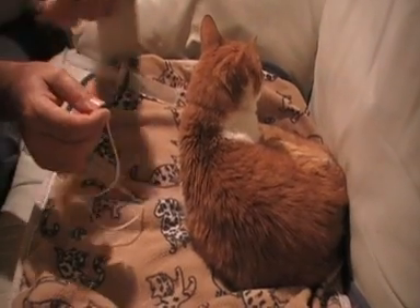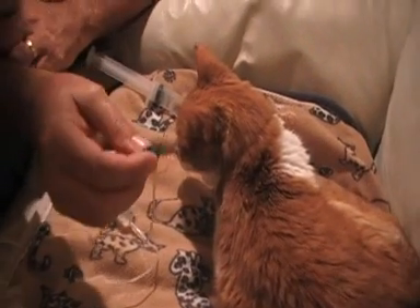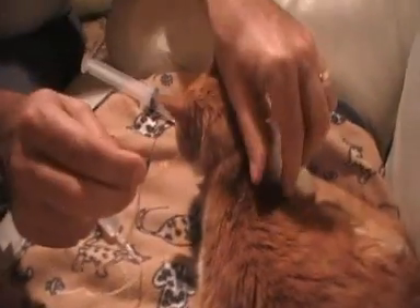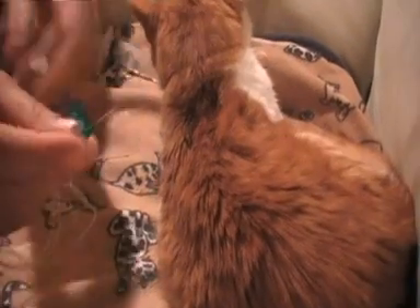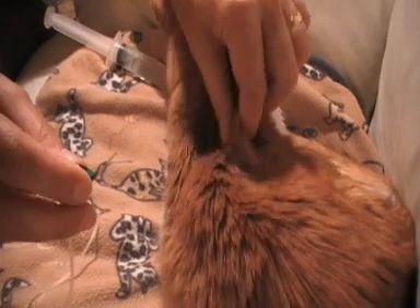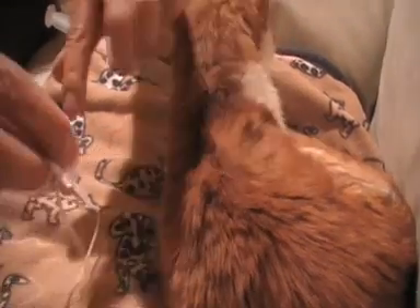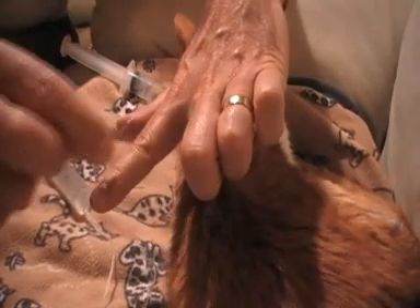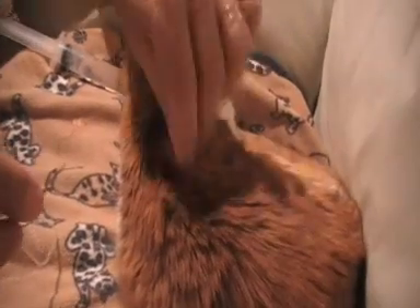We're going to demonstrate how to insert the needle as part of the giving-the-fluids process. The object is to hold the butterfly needle in the left or right hand, choose a side, one inch either side of the spine. We're going in under the skin — not into, but along the skin like that — for the subcutaneous therapy.